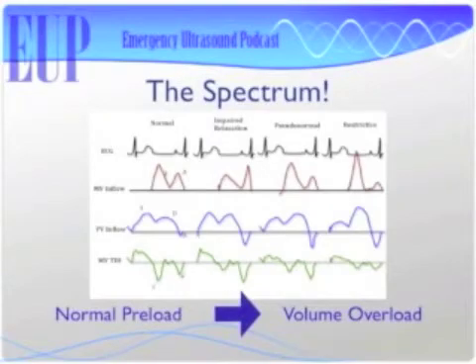Yeah, but I would also say that I definitely use it as an assessment of preload in patients that are sick with bad hearts. So I guess I would just urge people not to just depend on the IVC in patients who have heart failure at baseline. So what I'm saying is the patient who has a big dilated IVC with heart failure, their heart might be used to a little bit more preload than you or I, right? So a big dilated IVC does not necessarily mean that you've met their ideal preload yet. So diastolic function can tell you how much further you can push their preload.